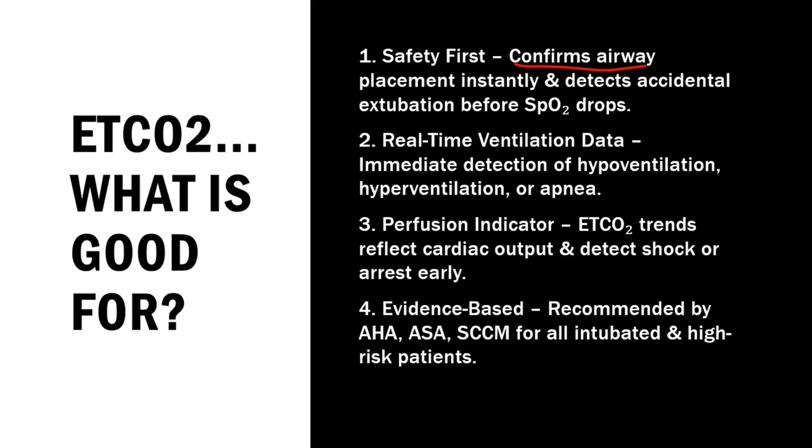And also with those colorimetric detectors, the ones that turn from purple to gold, those are just pH paper that as soon as they get exposed to that CO2, they change colors and they never change back to their original color. So it'll tell you, hey, yeah, I detected CO2, but it won't give you a consistent reading saying, hey, I can guarantee you that you are inside of the lungs right now.